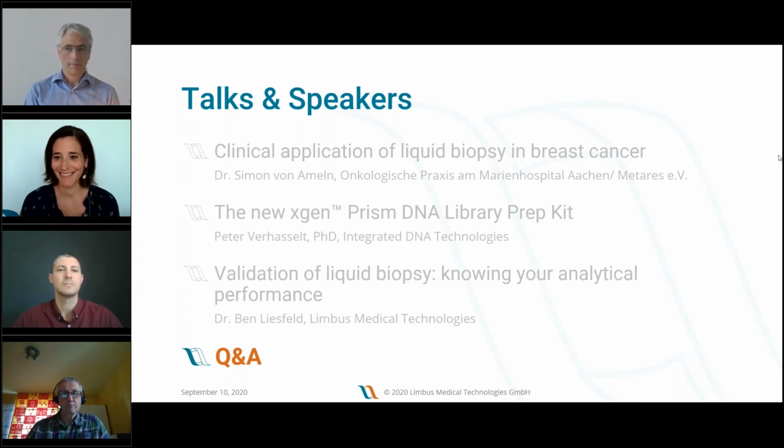Next question for Simon. Does the panel capture the whole coding sequence of the 5 genes, or only focus on hotspots? It's designed for the whole coding sequence for all 5 genes. All included. Okay. And how many samples can be sequenced on a MiniSeq run?